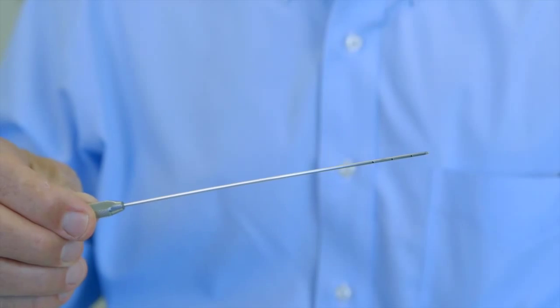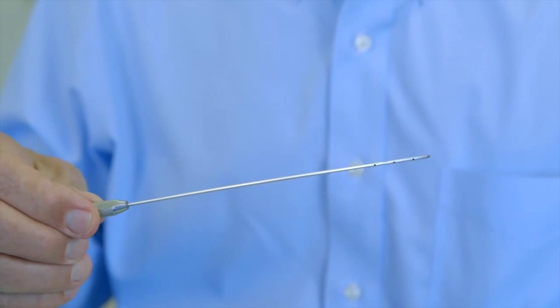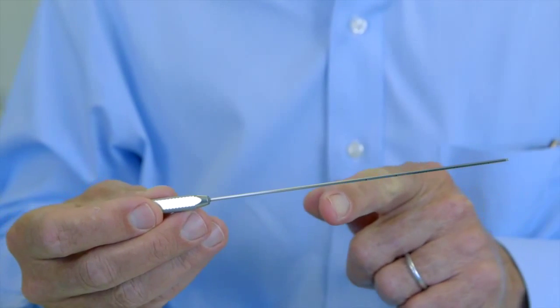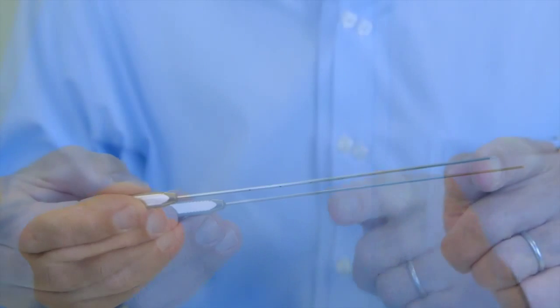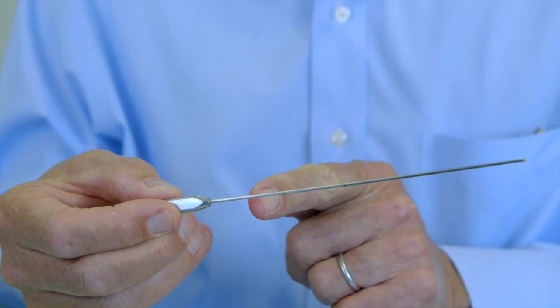There are three types of Monty cannulas. There's a tip Monty cannula with holes just at the distal end of the cannula, a half Monty cannula with holes down the distal half of the cannula, and the full Monty with holes ranging virtually the entire length of the cannula.